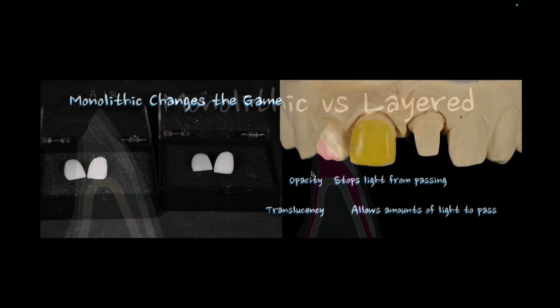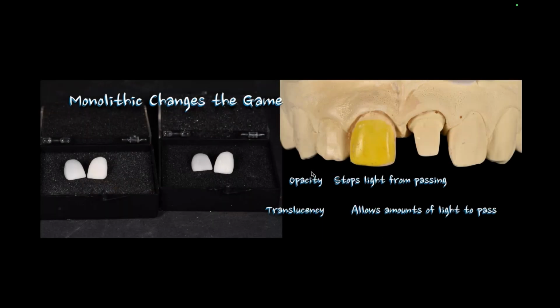Here's a great example of something that I was just working on. I didn't finish this case yet. I'm actually just starting it. But the doctor sent me the case. This is actually one of Dr. Bernadette's cases. And she forgot to put the photos in Dropbox, right? So I was kind of rushing to get it done. And I said, oh, let me just press it out. I looked at a picture of the patient pre-op. And I thought, okay, not so bad, and it should be fine.